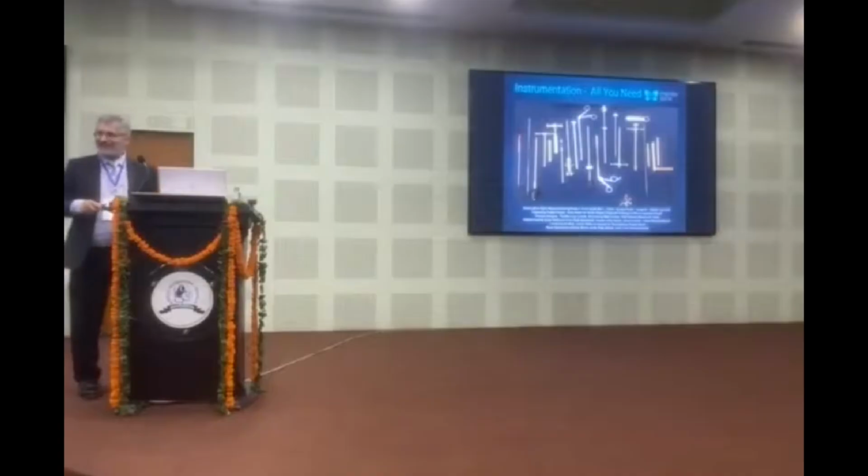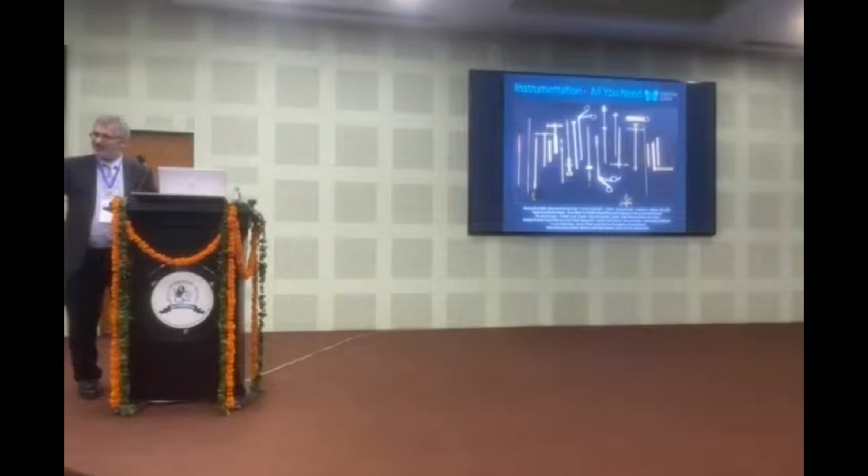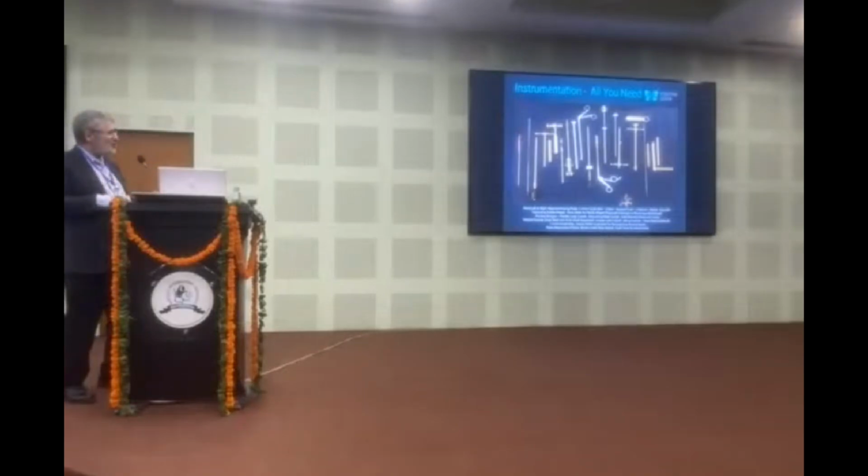And this is what I did in the last 12 years, refine those instruments so that they do one job only, but they do their job so well, and you don't need a 5-set of instruments to perform it. And then at the end, you package the biologic and you put a cage in. This is the version 4 cage, and if I blow it up, you will see that it's biconcave in the tip, biconvex at the end plate.